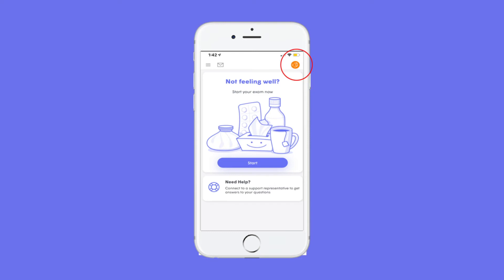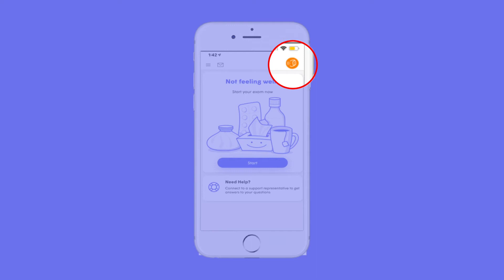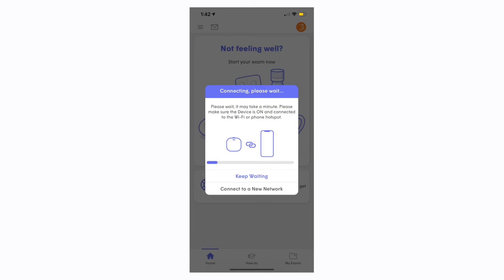Tap the orange button on the top right of your screen to connect your device. While your device is connecting, your screen will look like this. When your device is connected correctly, the orange bubble will turn green and say: Device Connected.